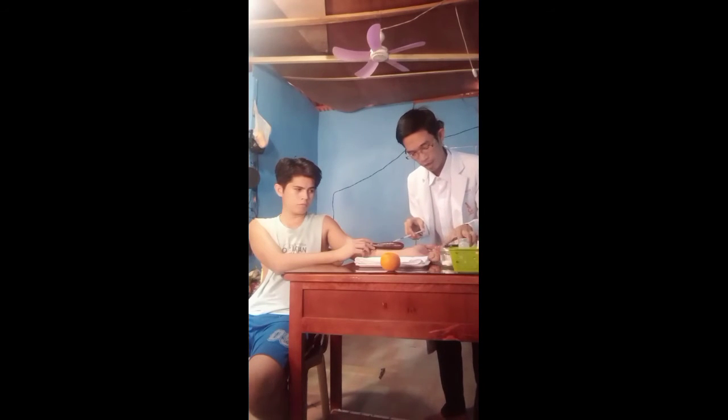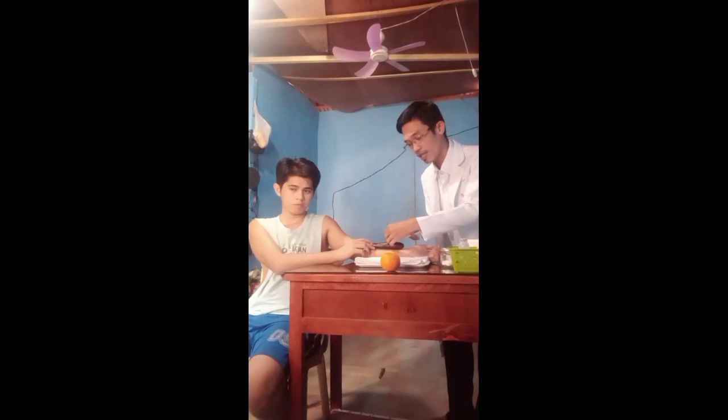So you need to prepare the dry cotton balls. And the non-dominant hand can stabilize needle during the injection. So slow injection minimizes discomfort at site. So dermal layer is tight and does not expand easily when solution is injected. And stabilizing needle prevents unnecessary movement and decreases patient discomfort.